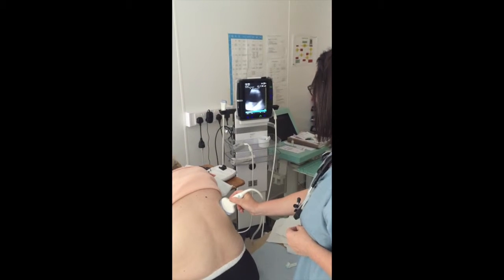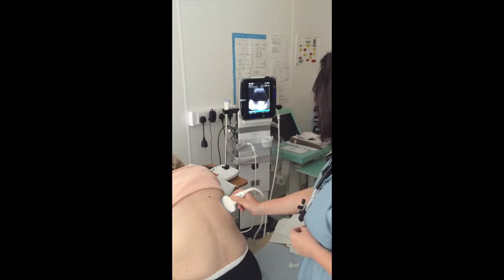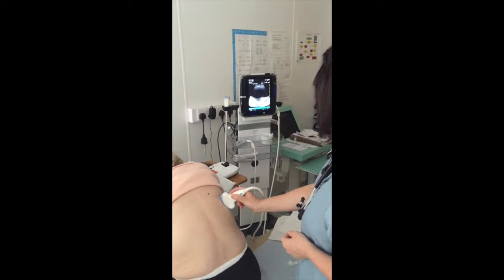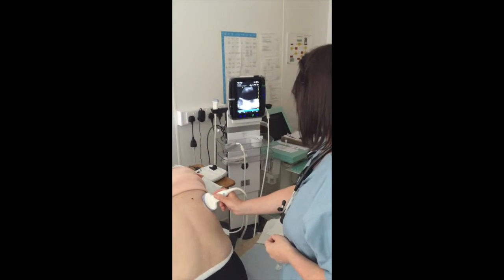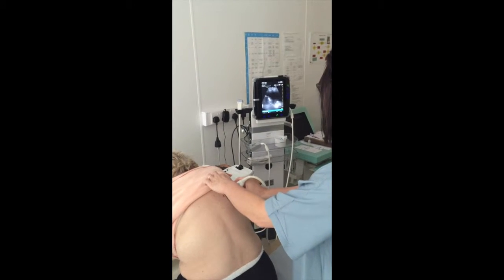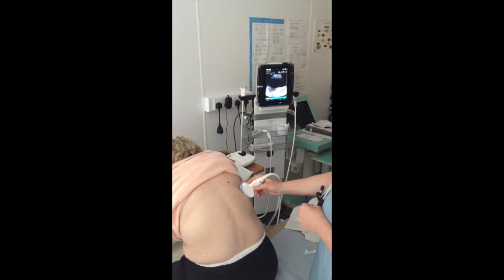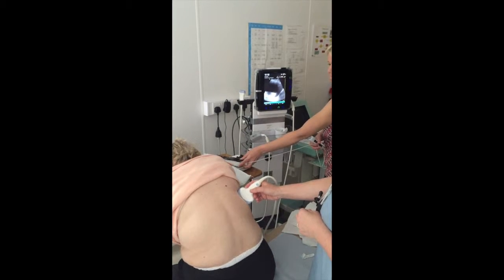Then what we're going to do is have a look up here, and now you can start to see the lung coming in there at about 6 o'clock at the bottom. It's not moving around very much, which can signify an underlying trapped lung, and she's certainly got a large collection under there. We know from the CT scan that she's got collapse under there as well. Looking further up here, you can see that the effusion goes right the way up to the top there. It's coming down again down here now. So that's a really large effusion, and possibly some underlying trapped lung as well.